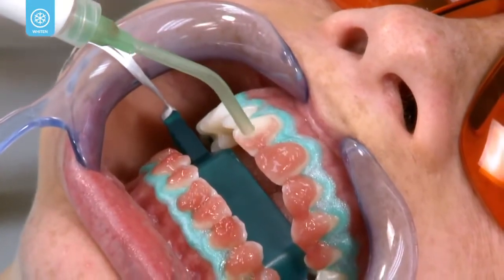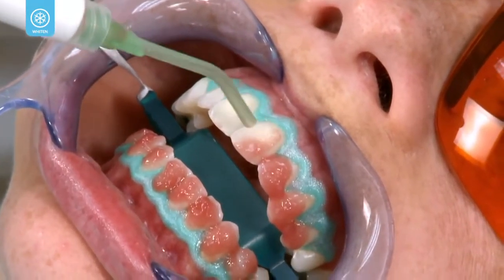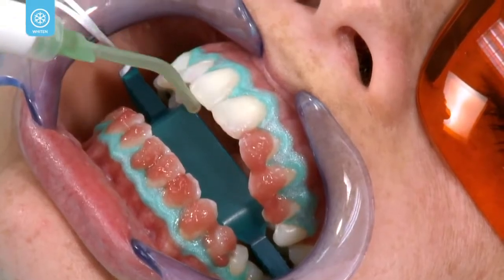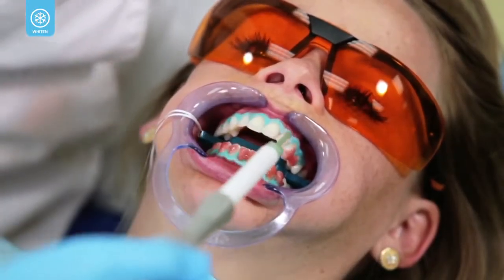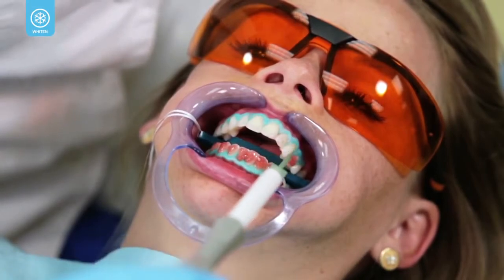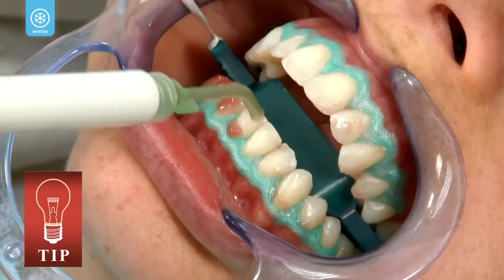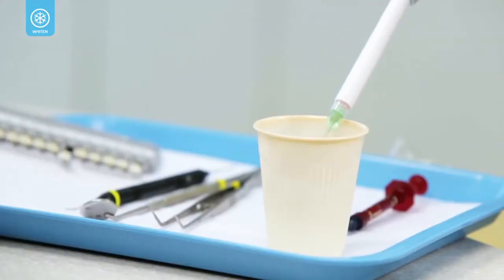Remove the gel using suction only. To prevent Opalescence Boost from splattering onto the soft tissues, do not use water to rinse during the initial suction. Suction the gel from the teeth using a luer vac and surgical suction tip. Use caution not to dislodge the isolation barrier. Tip: clear suction periodically with water.